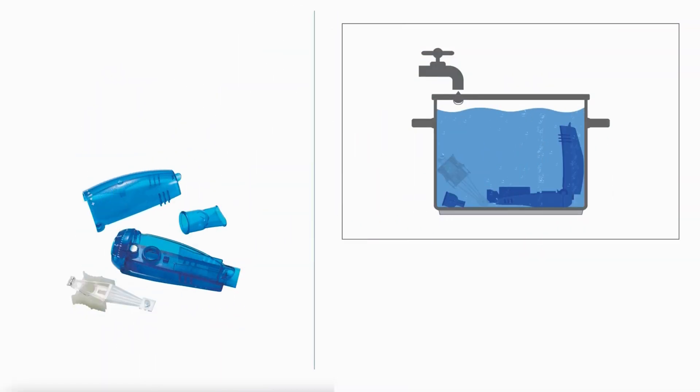After each use, disassemble and rinse all parts with warm water. Shake off extra water and let everything air dry. Daily, wash parts with mild dish soap and water, then rinse and dry.